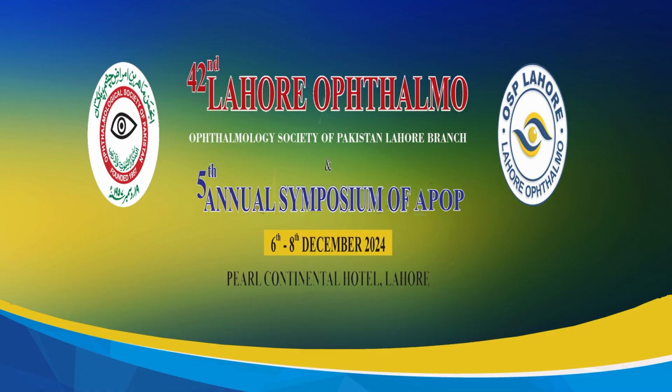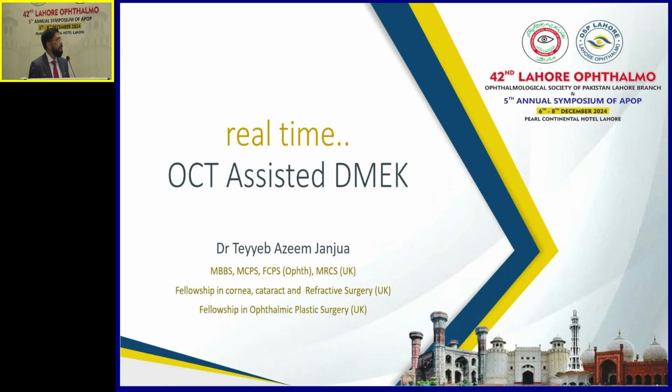I have not measured the eyeball. But I think if you are going to remove a 350 in a cornea which is preserved in fluid, you're going to end up in a 400. That means 400 will become about 325. So it will be much thicker and it will be difficult to do it. It all depends on the pachymetry.